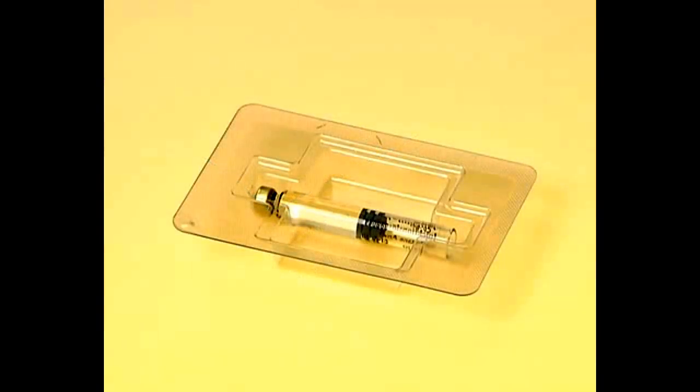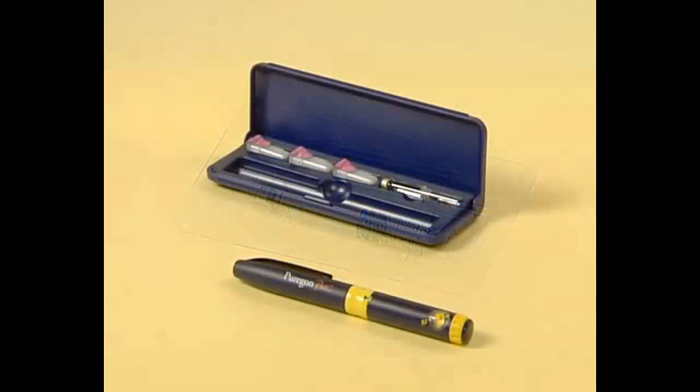Please note, however, that once the cartridge has been pierced by a needle, the cartridge can only be stored for a maximum of 28 days, between 2 and 25 degrees Celsius. It is also important to protect the Purigone cartridges from bright light.